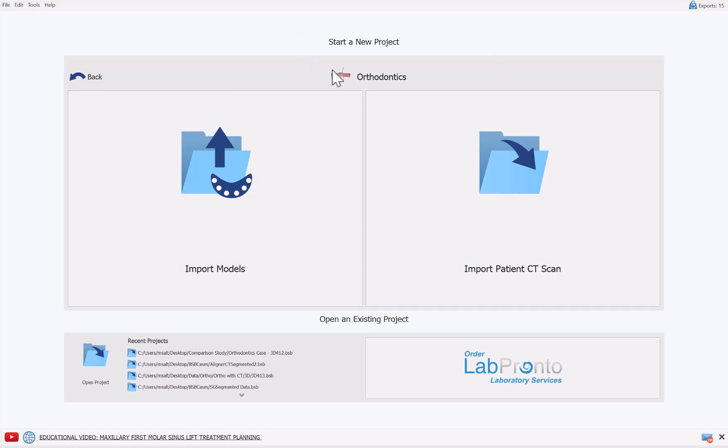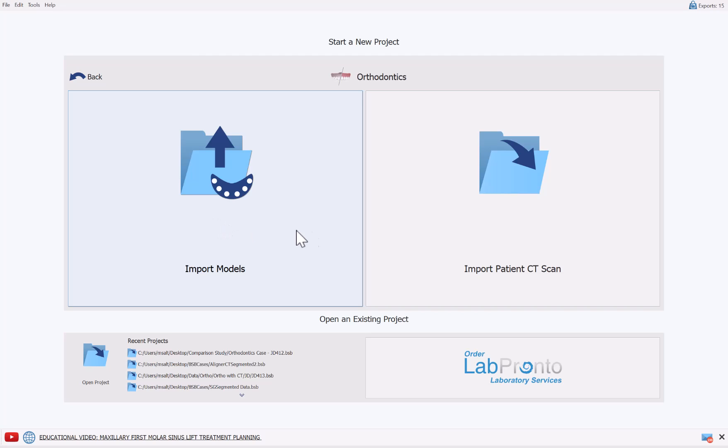While you could definitely use BlueSky Plan for those optical scan-only cases and go through the traditional flow, in this tutorial, we're going to be emphasizing and focusing on the process flow that includes the patient CT scan as well as the optical scans.